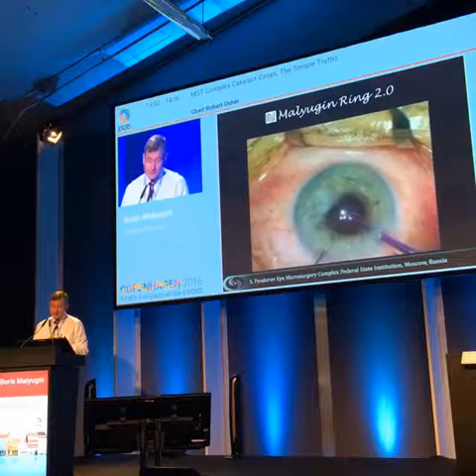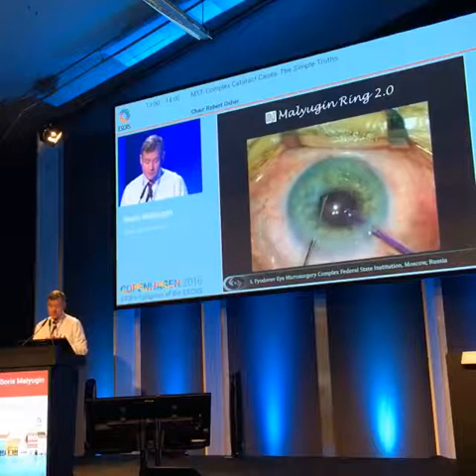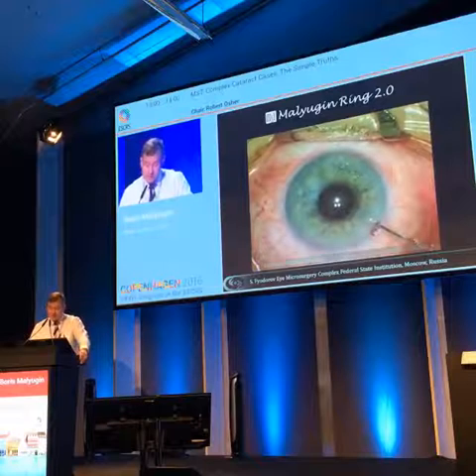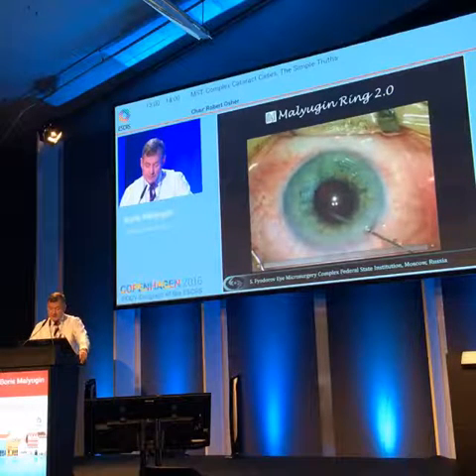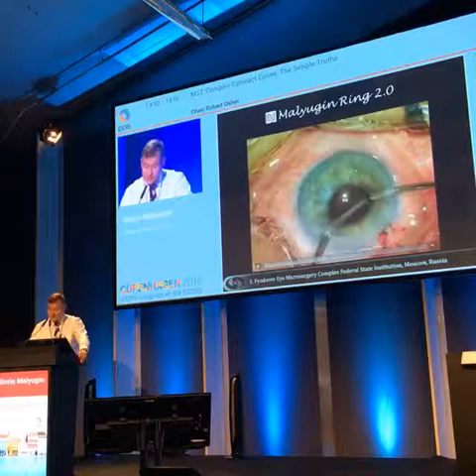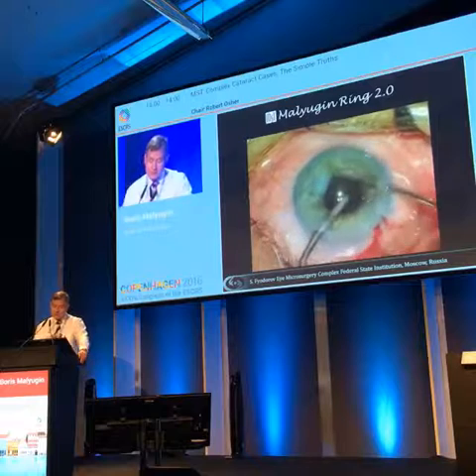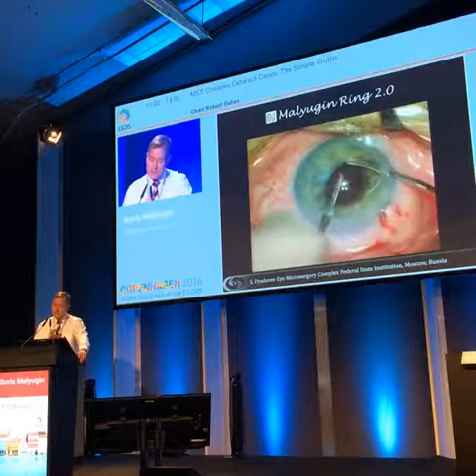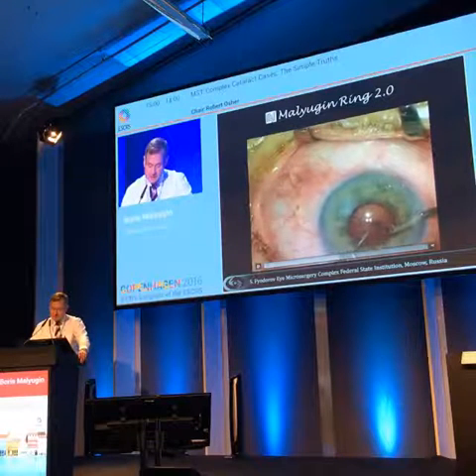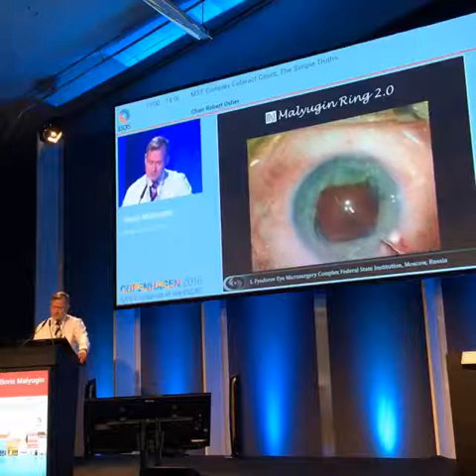And finally, I was a little bit nervous at that point because I was thinking that maybe I will damage the iris, and that's why I thought that it's time to inject the ring at this particular point, because we really need to expand the pupil. But before that, I was thinking about irrigating, aspirating at least some of the cortical material, which was done in this case, but then I thought that probably the ring will be much safer.